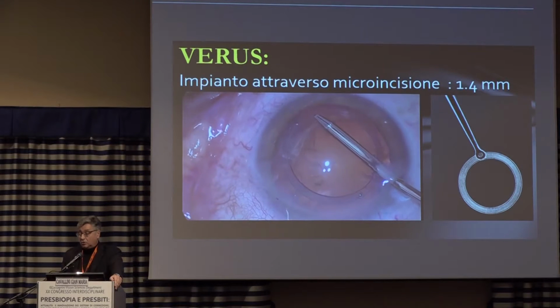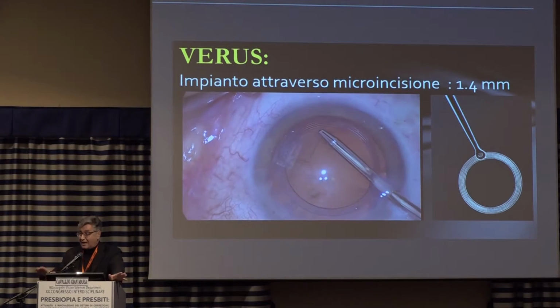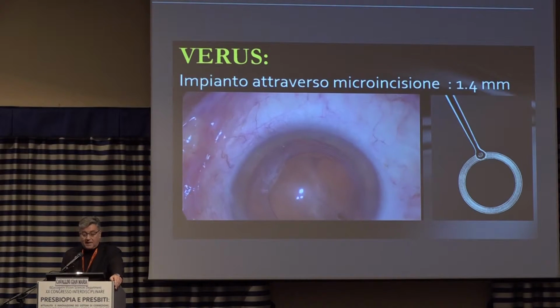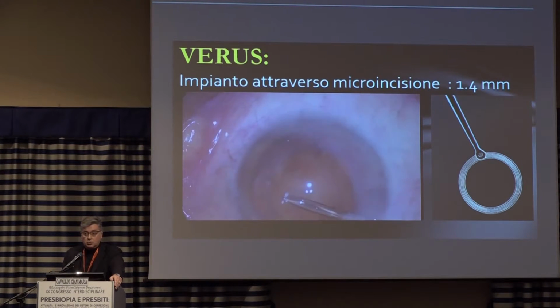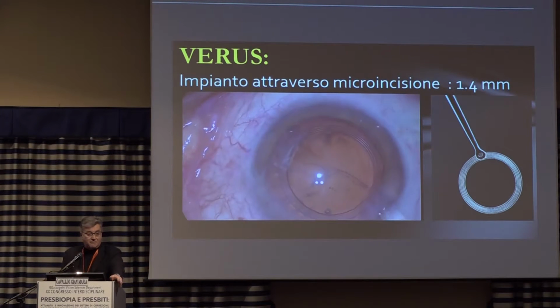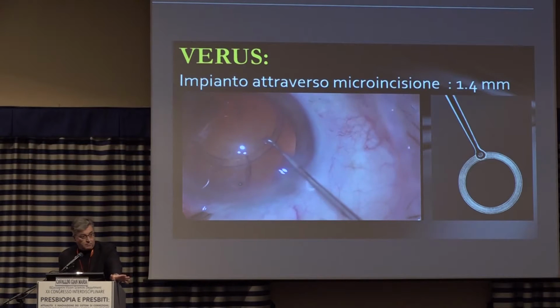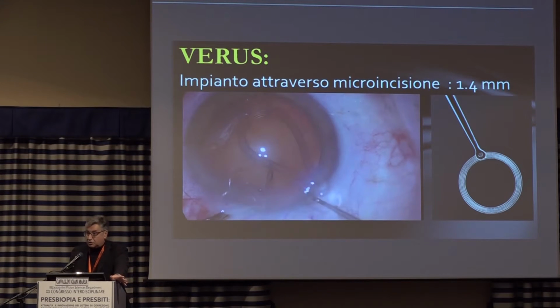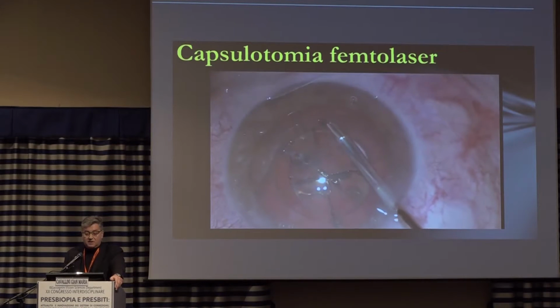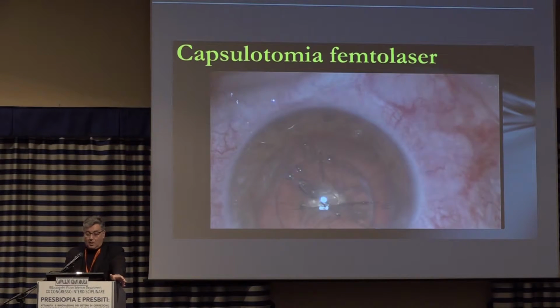You place it in the anterior chamber. You inject viscoelastic material, also to push it on the lens so that some form of imprint is left, and then you use the edge of the ring to make the capsulorhexis as circular and homogeneous as possible.